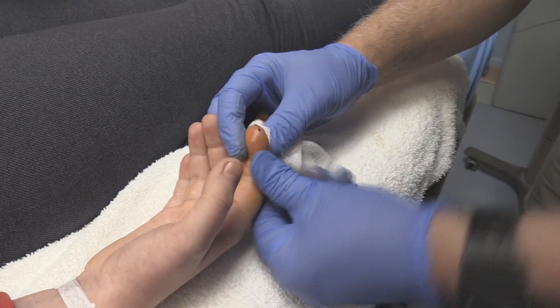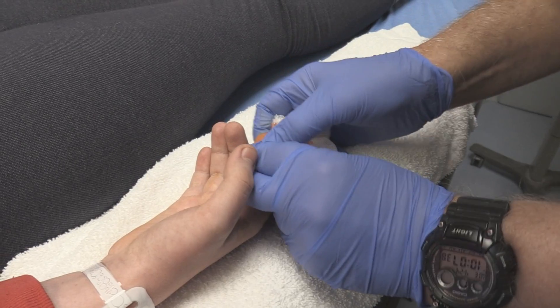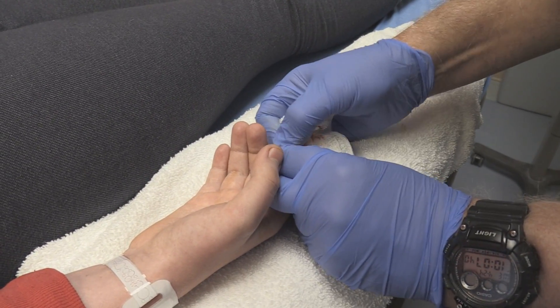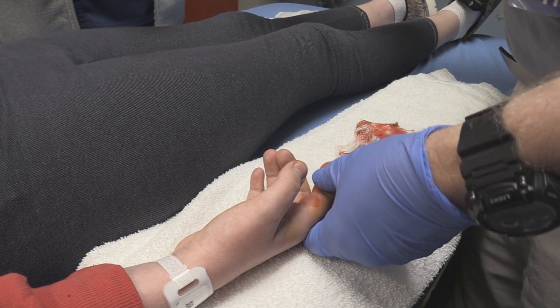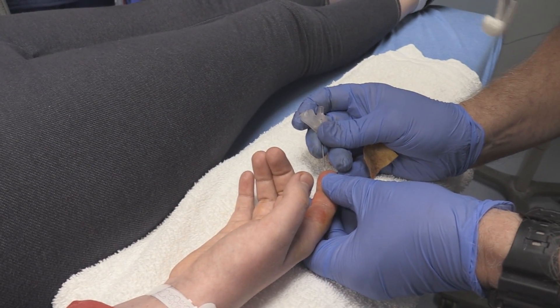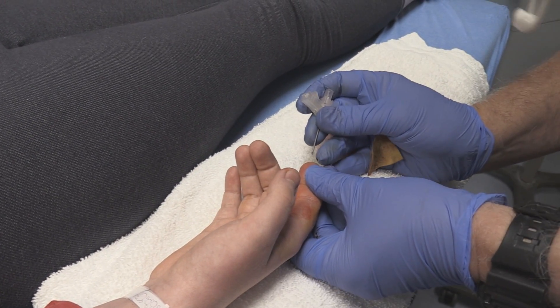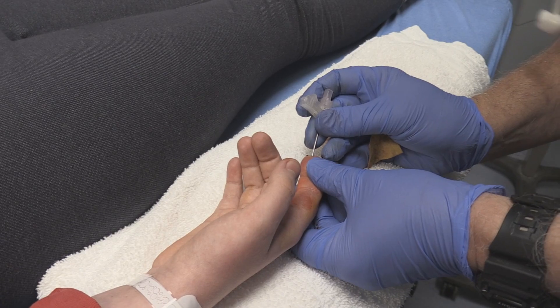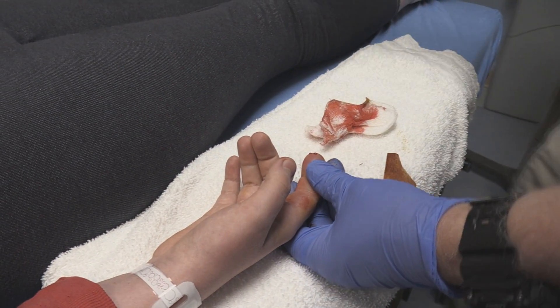You can see I did get a little. Now I'm going to massage this a little bit. It does look less swollen — it feels less swollen too. I may just go up in here and do a bit more.